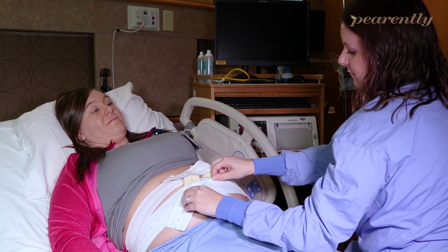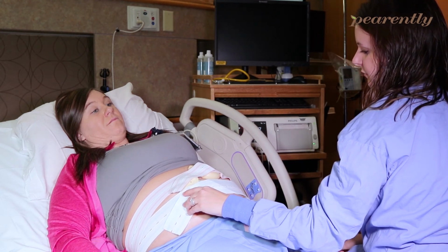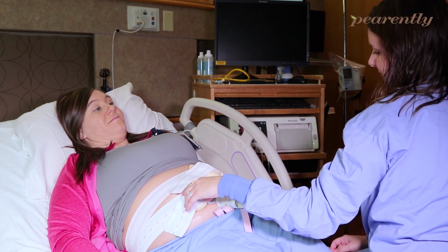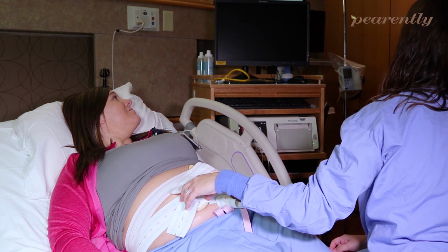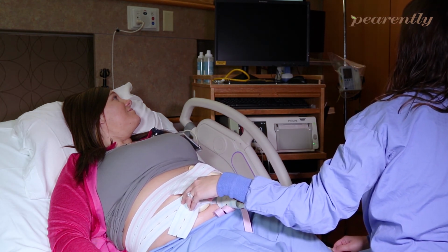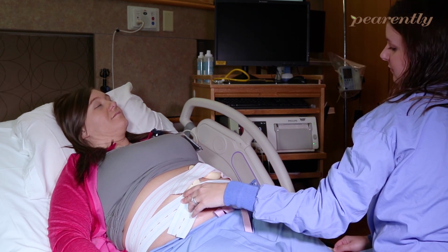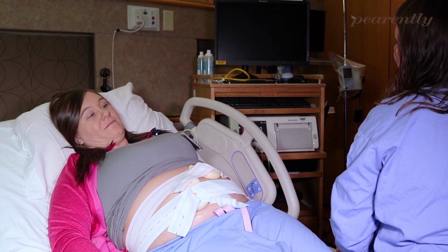So the patient sometimes is asked to drink some fluids. Sometimes they get IV fluids. Sometimes they have to drink something sweet like some apple juice. This will all improve the chances that the baby will be normal in its heart rate evaluation. After we monitor for a minimum of 20 minutes, we score this as a category 1, 2, or 3. So this is how a non-stress test is performed.